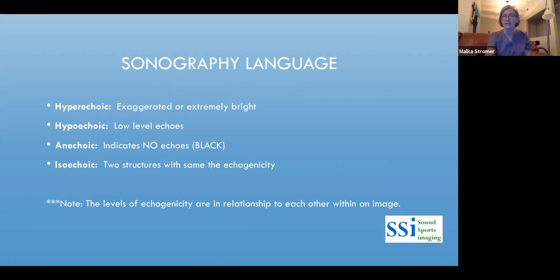Sonography language: hyperechoic means extremely bright — that will be bone. Hypoechoic means low-level echoes, less than the surrounding tissue. Anechoic means no echoes — that's black, generally fluid or blood. Isoechoic means two structures with the same echogenicity. All of this is relative: bone is hyperechoic to the tendon next to it, so the tendon is hypoechoic relative to the bone.